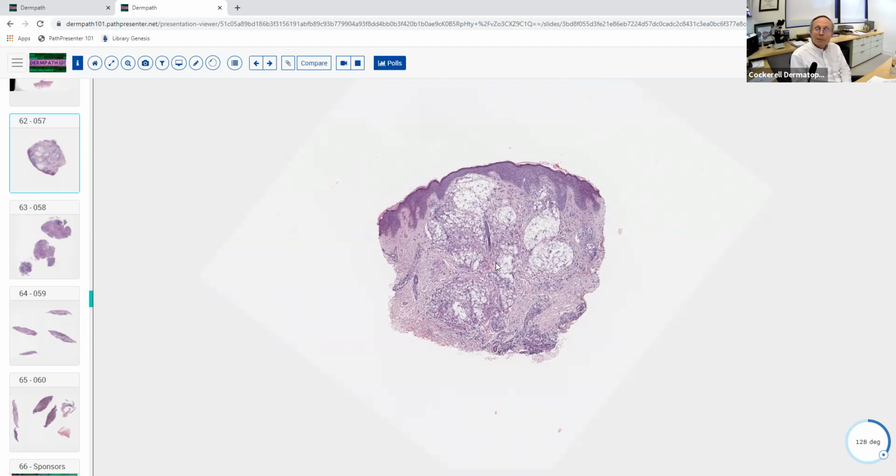So here we got a punch biopsy. And notice how you got all this white stuff in here, low magnification. Well, what causes white in the skin? Lipid, mucin, and glycogen. That's about 90% of it right there. Then you get other clear staining cells that have other stuff in their cytoplasm that makes it look clear, like we said, balloon cells and renal cells, probably glycogen actually inside those cells there primarily. But there aren't too many things that actually are truly present in the skin and are not artifactual that give you clear low magnification. So here we're going to see what all this stuff is.